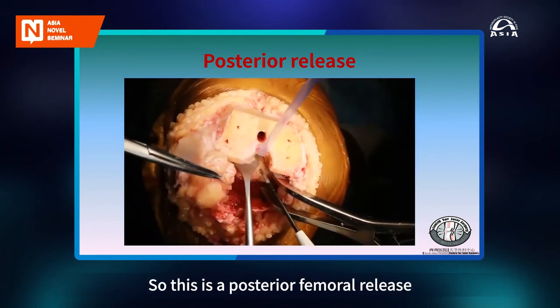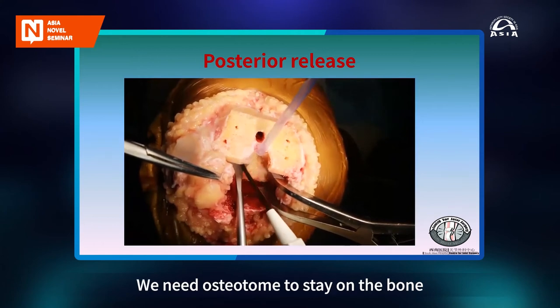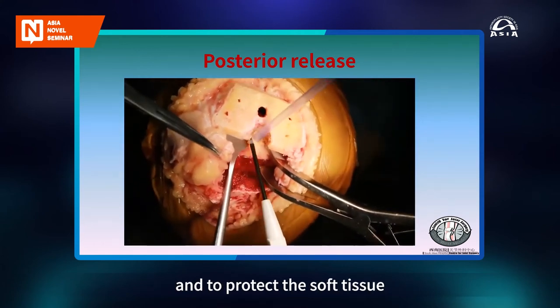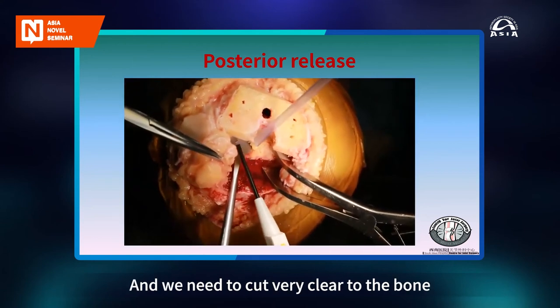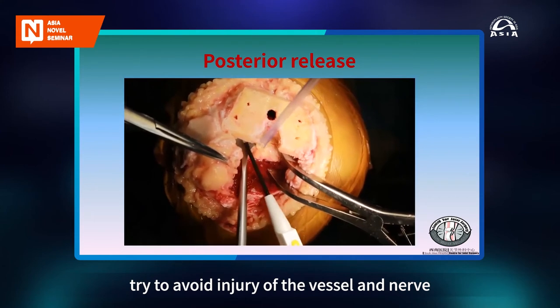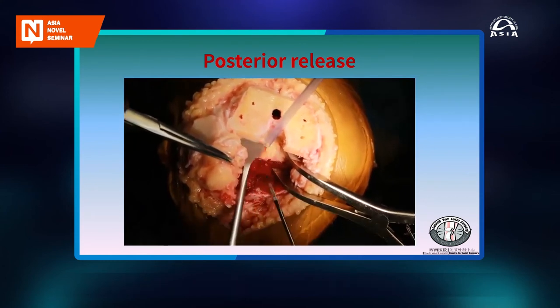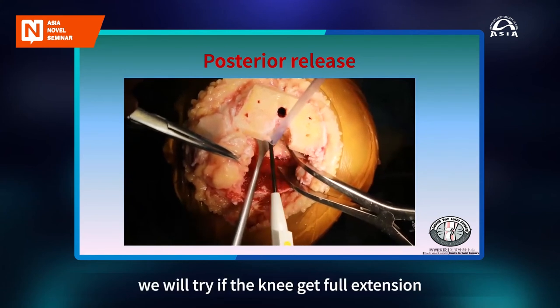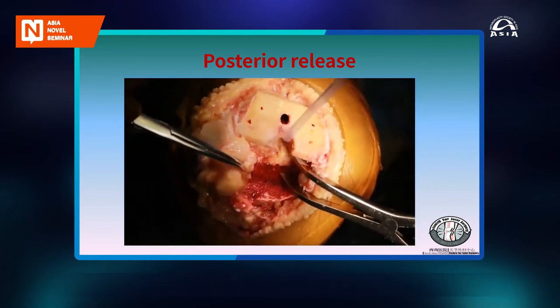So this is a posterior femoral release. We need the osteotome to stay on the bone and to protect the soft tissue. And we need to cut very clear to the bone, trying to avoid injury to the vessel and the nerve. After we get enough release, we will check if the knee gets full extension.